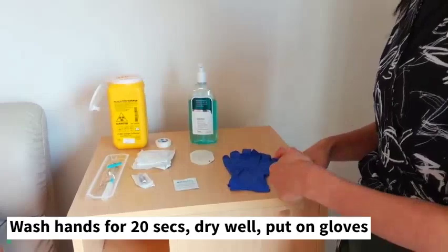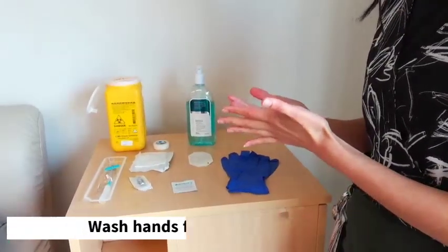When we insert the subcutaneous line, we need to wash and dry our hands thoroughly and then put on gloves.